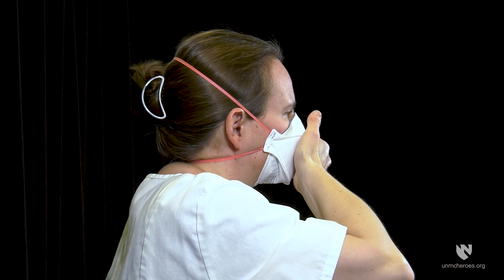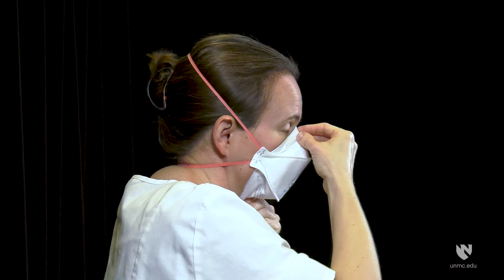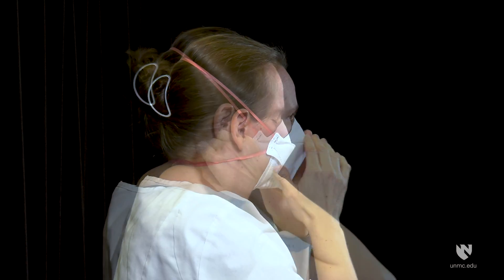Perform a user seal check. Place one or both hands completely over the middle panel. Inhale and exhale sharply, being careful not to disturb the position of the respirator. If air leaks around your nose, readjust the nose piece as described previously. If air leaks around respirator edges, adjust the panels and position of straps and ensure respirator edges fit snugly against the face.